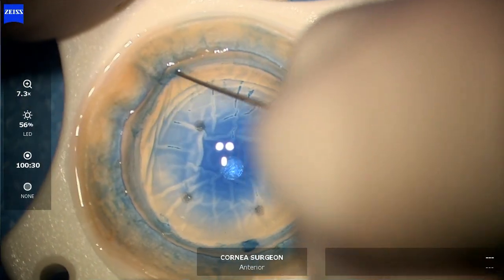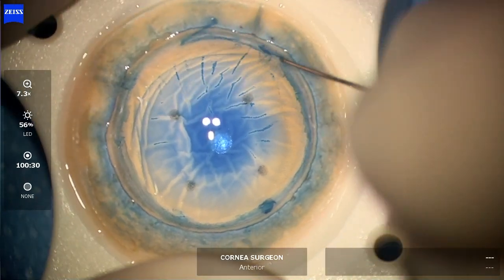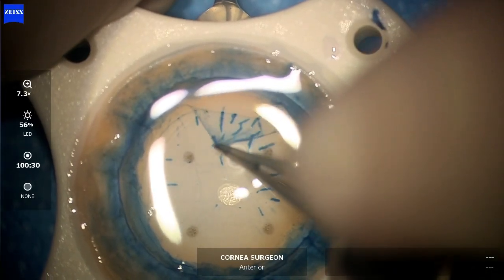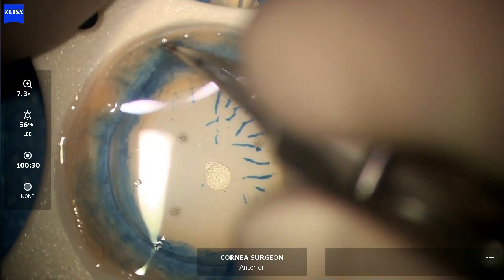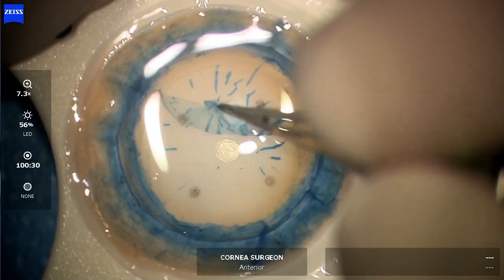There is another case here which shows a similar method. The method can be designed to cut the initial marking as a reverse seven, so when it flips around it becomes a seven as the correct orientation, or the other way around.